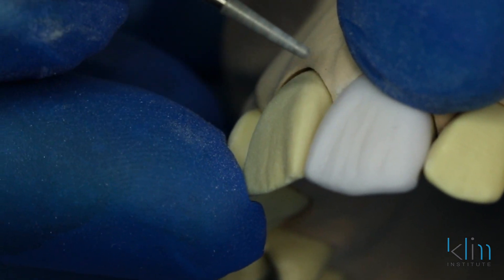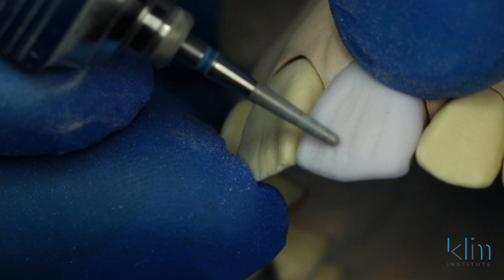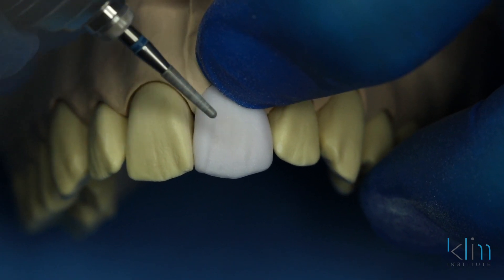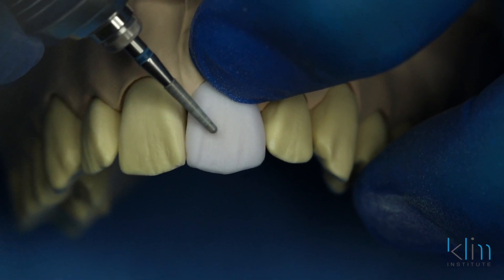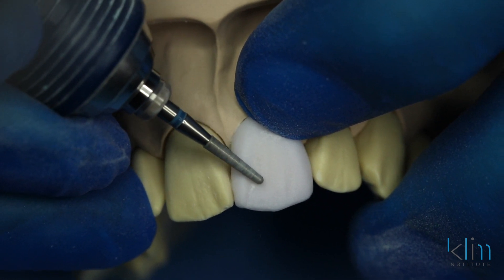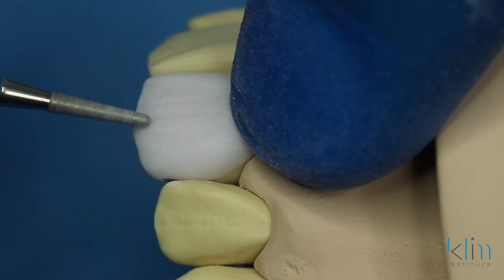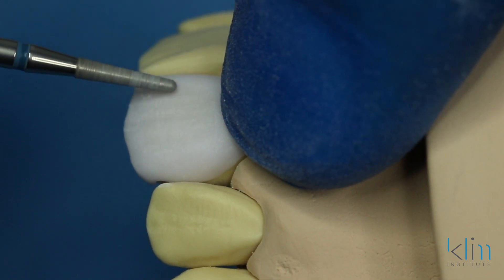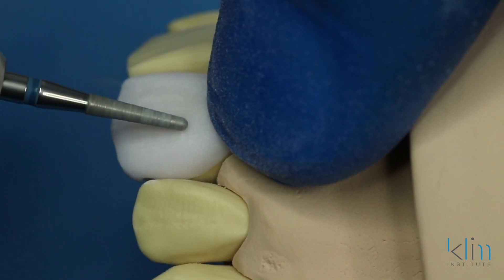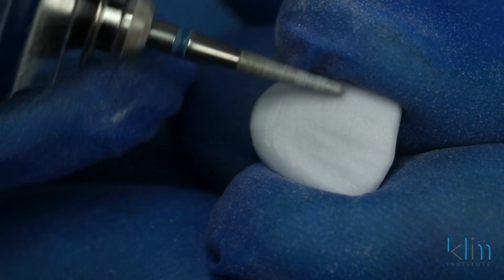This restoration has a unique texture — when you look at the tooth next door in the midsection of that mesial primary groove, it has the look of water on a windy day. One of the ways I create that is to take the tip of the burr and lightly vibrate it on that ceramic surface, which creates that nice effect. Whenever I'm creating texture, I have to think about how I'm going to finish, because you want more texture to allow you to finish — either polish or glaze or both — since polishing and glazing will neutralize the texture. Always emphasize your surface texture and subtract during your final finish.